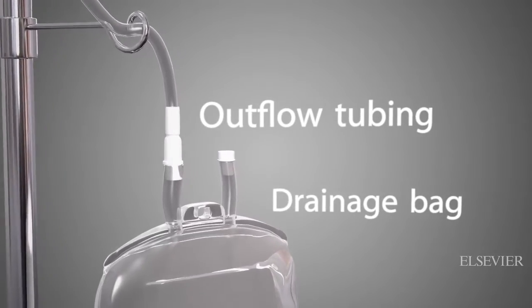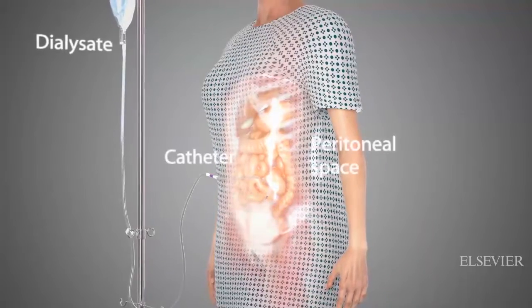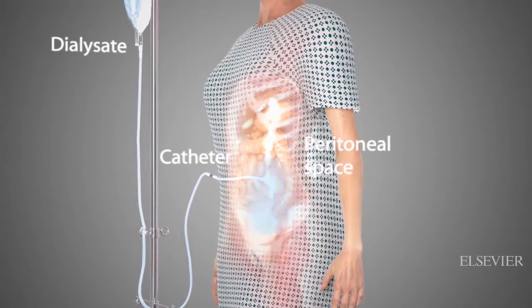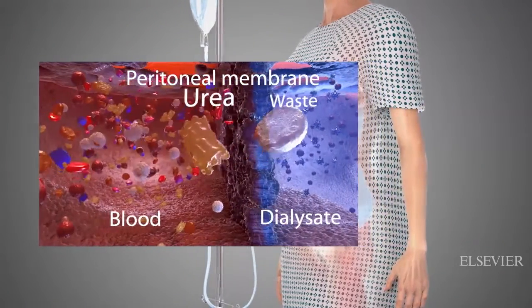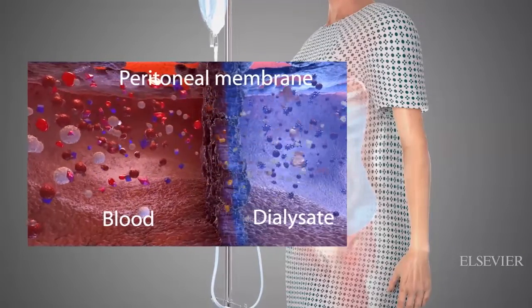Peritoneal dialysis occurs in exchange cycles. Each cycle has 3 phases. In the infusion, or fill phase, 1 to 2 liters of dialysate infuse by gravity into the peritoneal space. In the dwell phase, the dialysate stays in the cavity for a specified time.